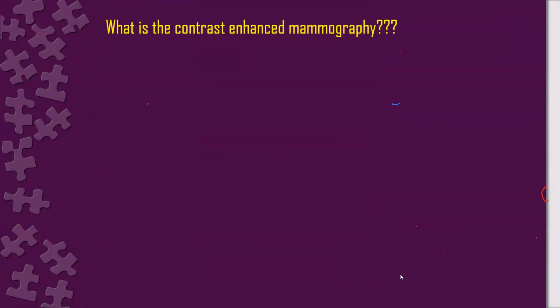So what is contrast enhanced mammography? We use a high technique. No, what do we call it? It's a dual energy technique, actually, with high and low. So the high and low make a subtraction for the image.